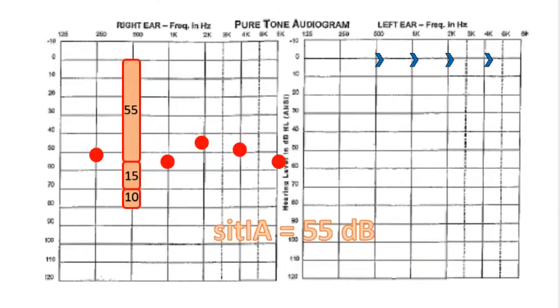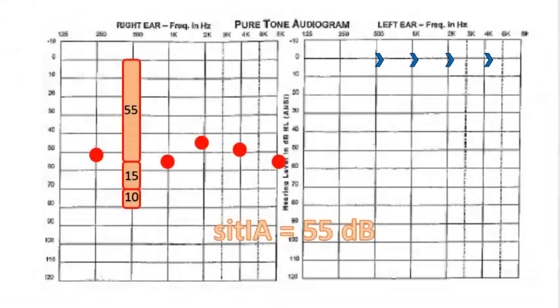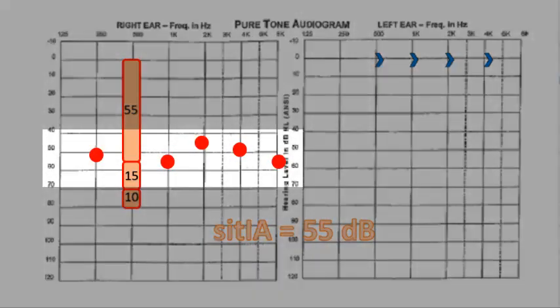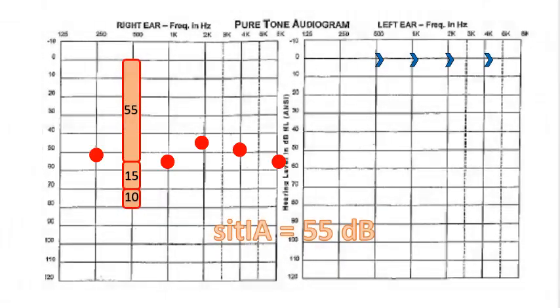Let's reconstruct the situation here. We're dealing with a left test ear that has really good cochlear bone conduction hearing. The non-test ear has poor hearing. We'll construct our initial masking level, and you can see the compensations that we mentioned in the previous slide.